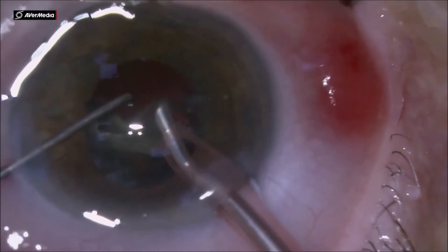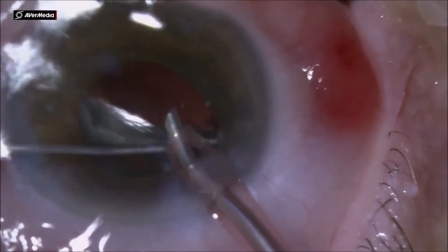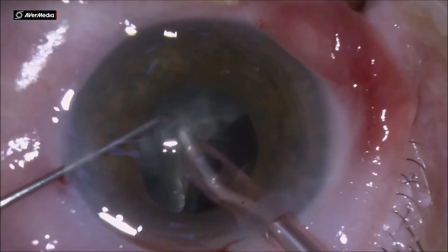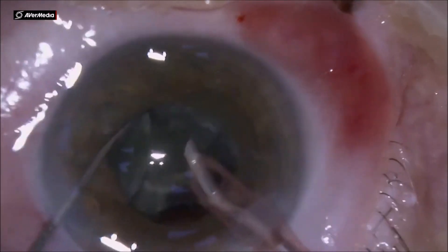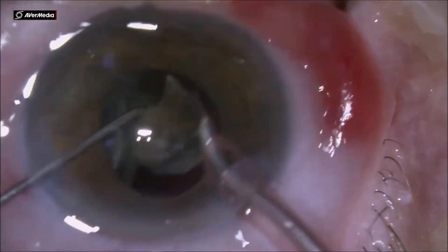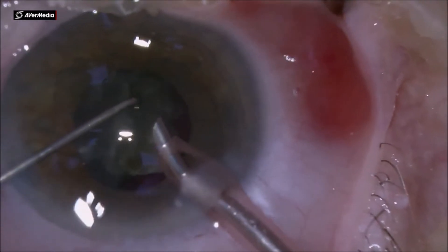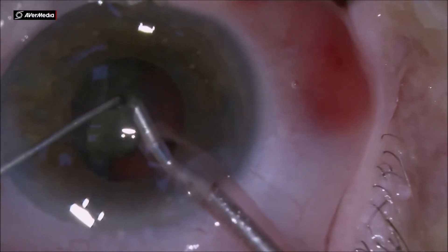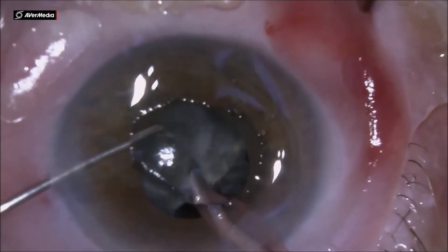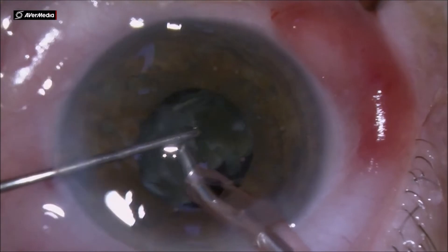You can use this kind of method not only for splitting one heminucleus but during the phaco emulsification as well, as you will see in a moment. I am taking out half of the other half, doing a split here and another X move — X pushing a core there. You keep one part of the nucleus steady with the vacuum from the phaco emulsification and then cross the instrument with the chopper and push, as you see here.